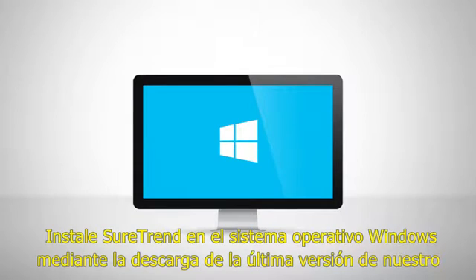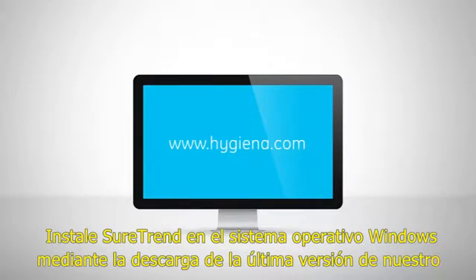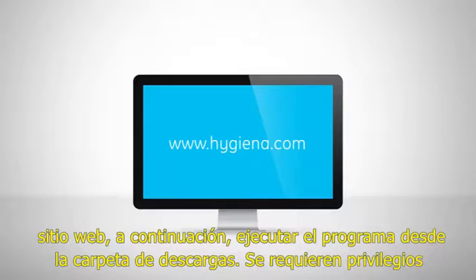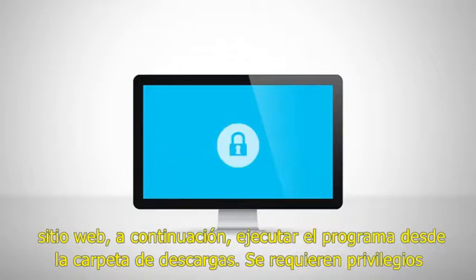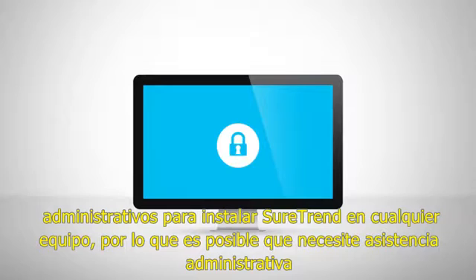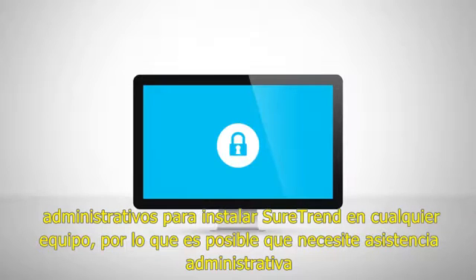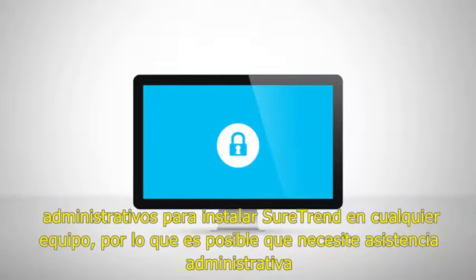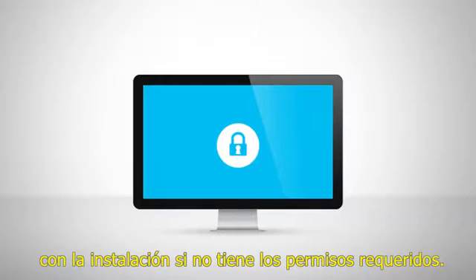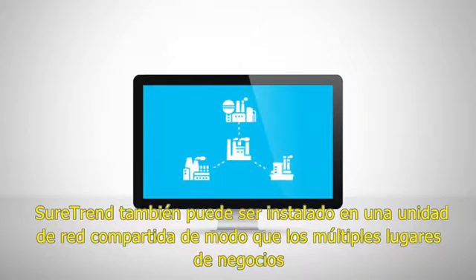Install SureTrend on your Windows operating system by downloading the latest version from our website, then running the program from your downloads folder. Administrative privileges are required to install SureTrend on any computer, so you may need administrative assistance with installation if you don't have the required permissions.